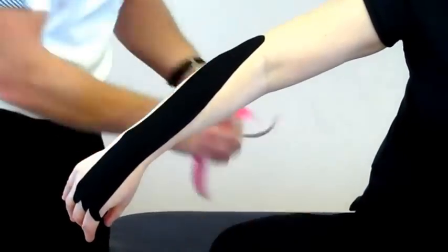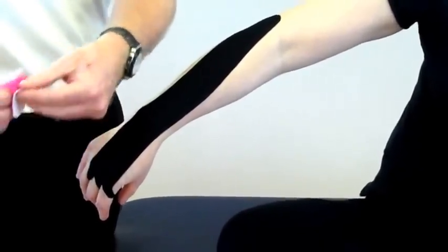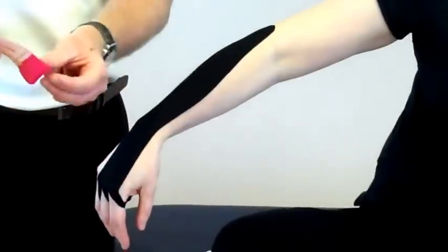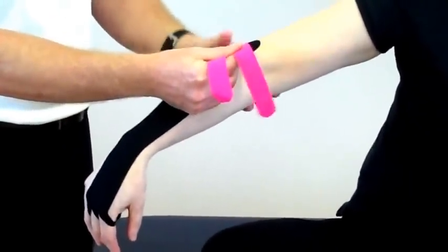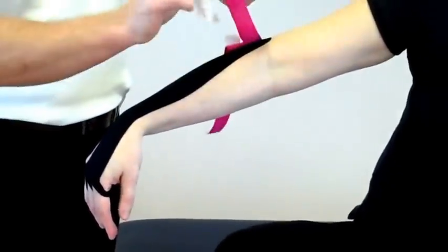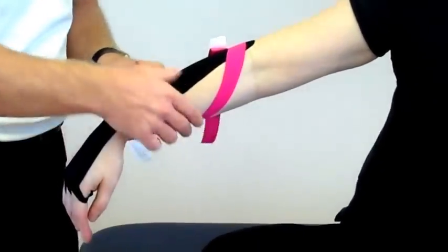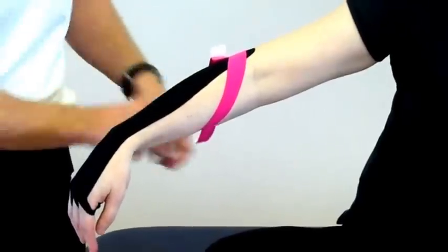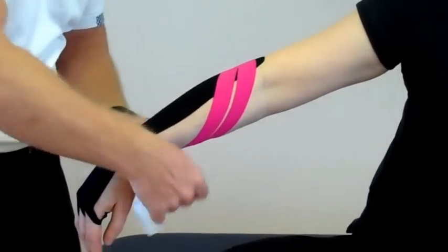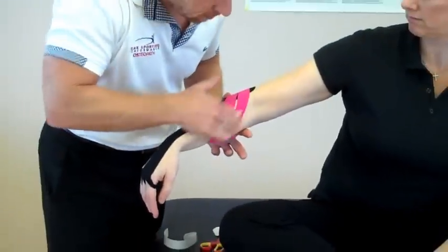The second tape is the smaller Y-strip. Peel back so it splits the legs. Where the pain is located around the lateral epicondyle, place this slightly posterior to the pain. Then the first leg — hold the tape at 75% stretch and just feed that around. And the second leg at 75% stretch, feed that around. You can use the back of the tape again just to warm up and activate the adhesion.